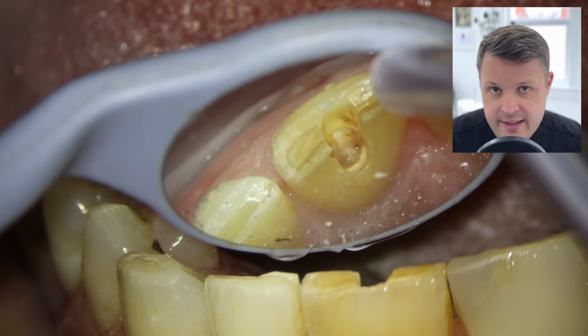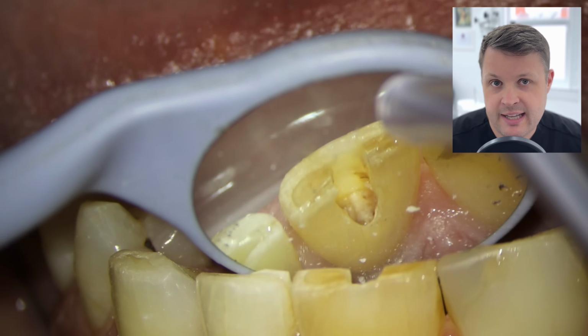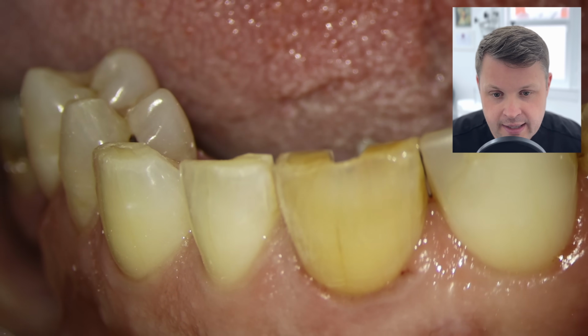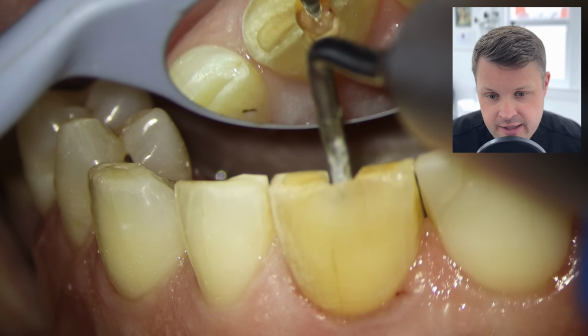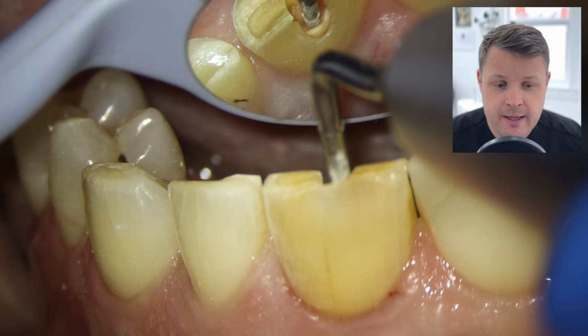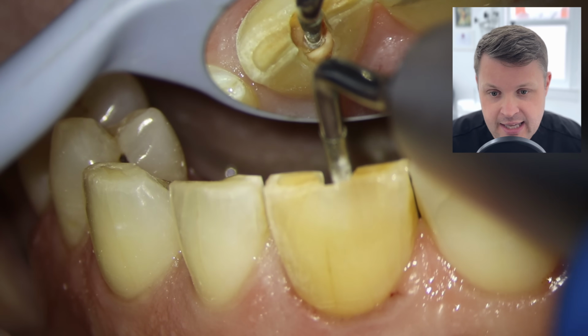I don't understand why there's soft affected tissue here, because the tooth is so calcified, but nevertheless it's a good idea just to remove everything. And then we're having a little look around, just to see if we can see any orifice there. To me, at this point, it isn't obvious. But obviously, on reflection, maybe there was something in the mesial aspect of this tooth.